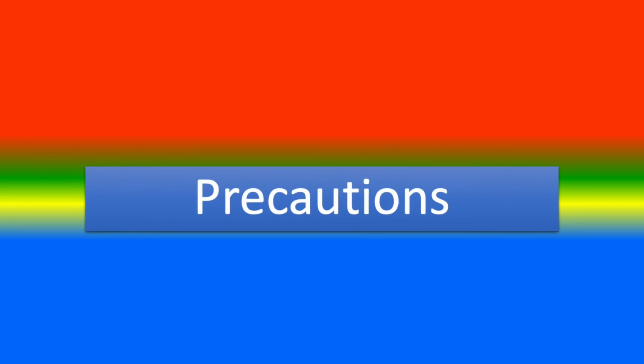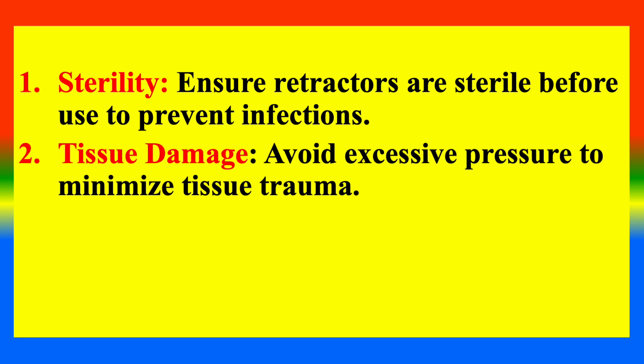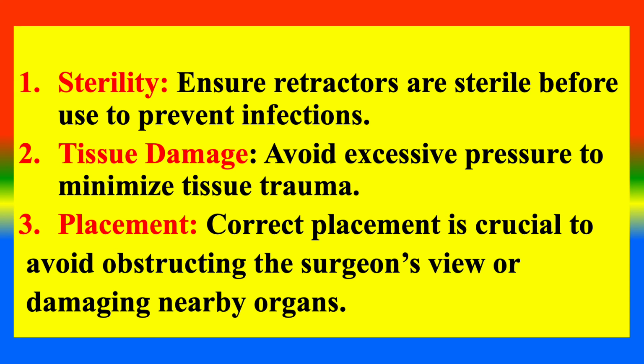Precautions. 1. Sterility. Ensure retractors are sterile before use to prevent infections. 2. Tissue damage. Avoid excessive pressure to minimize tissue trauma. 3. Placement. Correct placement is crucial to avoid obstructing the surgeon's view or damaging nearby organs.